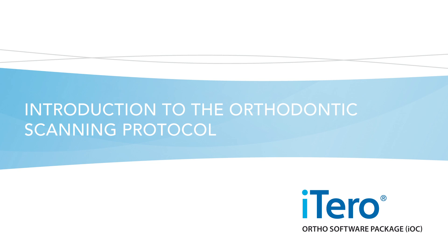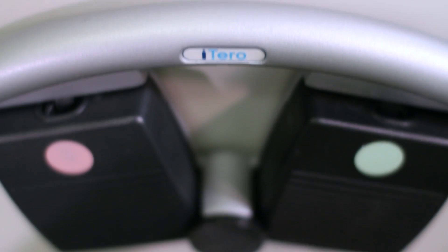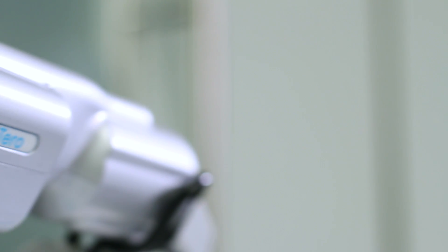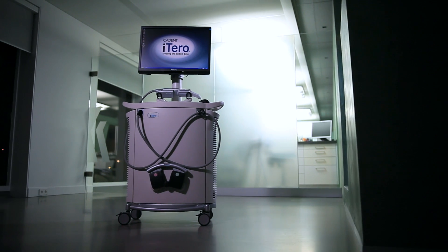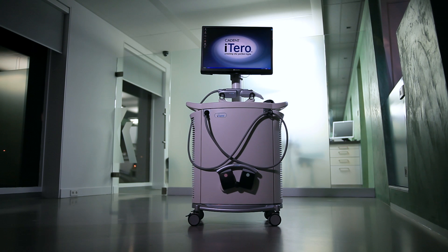Introduction to the Orthodontic Scanning Protocol. iTero, the world's leading intraoral scanner, allows you to capture highly accurate models of your patient's teeth without the use of powder, which can positively impact the treatment outcome. This training video will assist you to become familiar with the software and the scanning process.